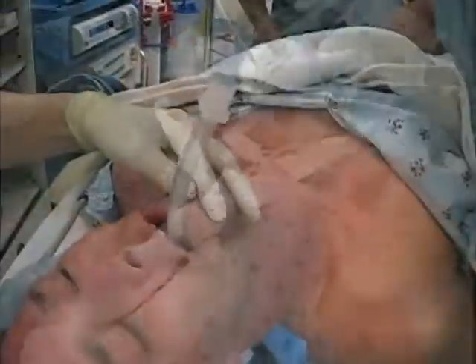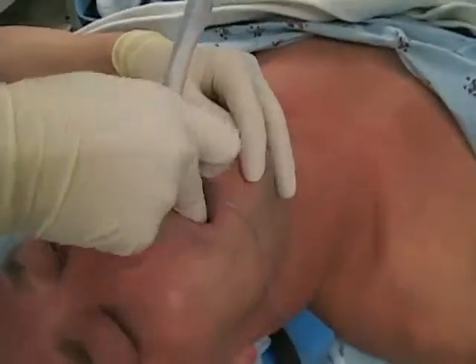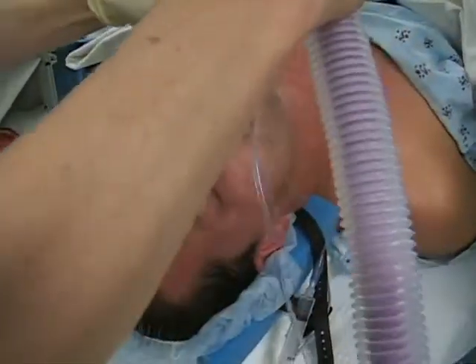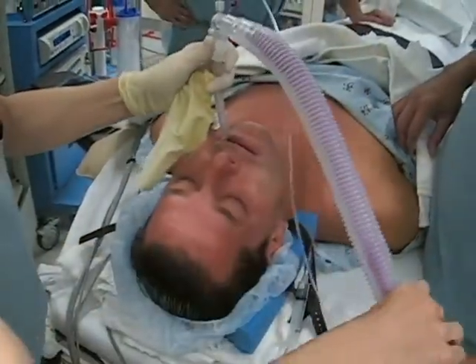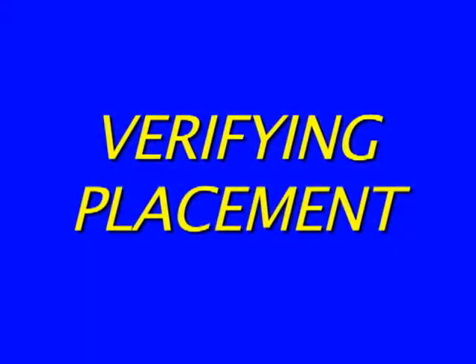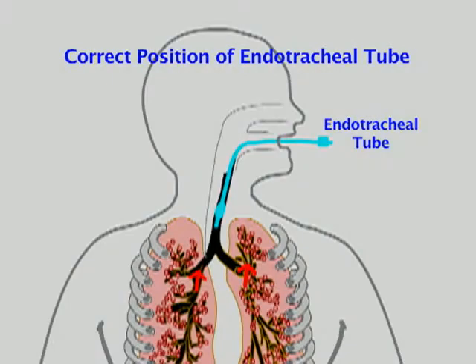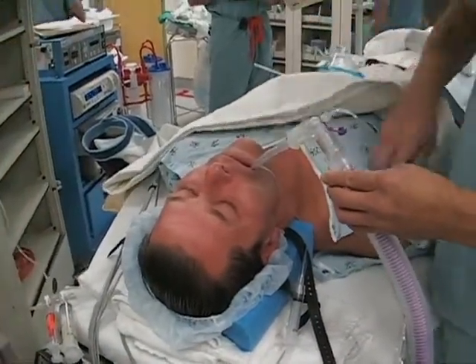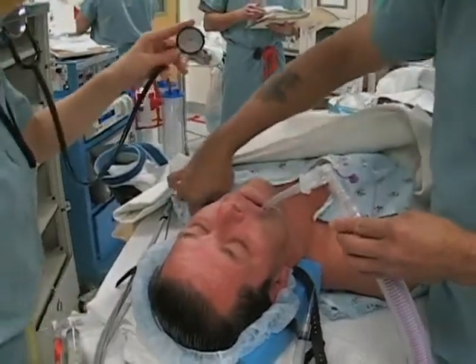Don't let the tube overlie the tongue. If it does, you risk accidental extubation because less tube is inserted into the trachea, despite the fact that the numbers at the lip in this situation inaccurately indicate an adequate depth of insertion. The correct position of the endotracheal tube places the cuff below the cords and the tip midway down the trachea to the carina. After intubation, immediately check that the tube is correctly positioned in the trachea, not in the esophagus or main stem bronchus.